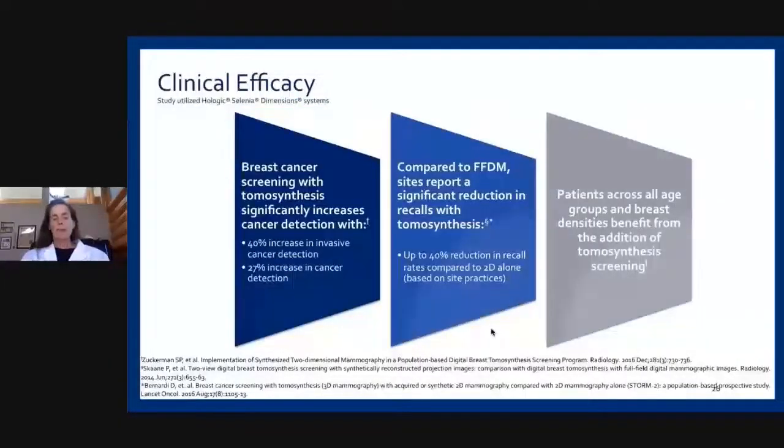So again, with tomosynthesis, you can have up to a 40% increase in invasive cancer detection rate, and then overall cancer detection rate up to 27%. And again, recall rates typically go down. And my own personal experience is that initially my recall rate went up a little bit with tomosynthesis because we were seeing so much more, and we really had to kind of reset what we were recalling. So initially mine went up, and then it did go down a bit.